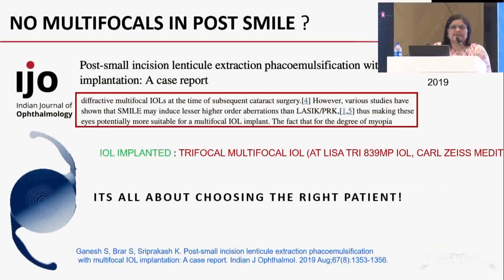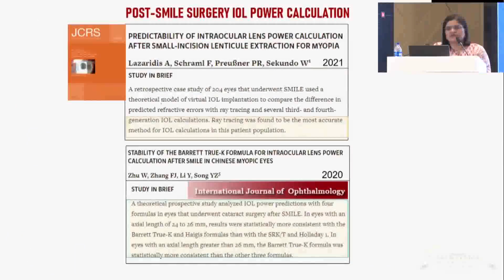If people say that in post-SMILE eyes we cannot implant multifocal IOLs, then a study was published where a trifocal multifocal IOL, an AT LISA, was implanted and the patient was pretty happy with the result. So I think it is all about choosing the right patient for these cases.